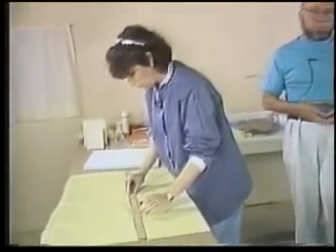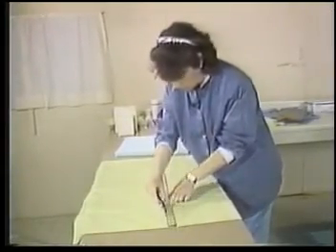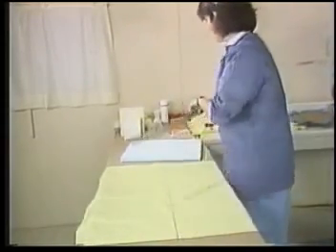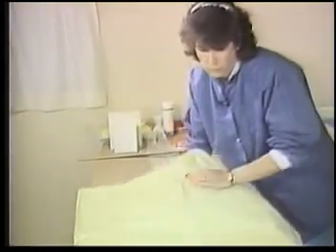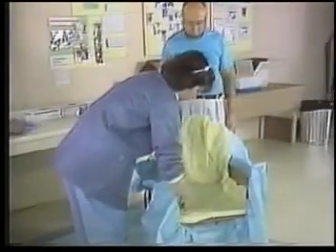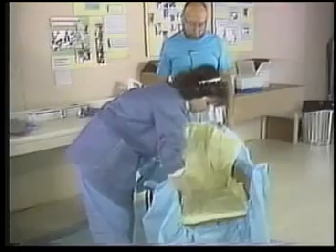Mark the center line from the top to the bottom on the bag using a broad tip marker and a straight edge. This center line will be used later to position the bag in the chair. Place the SunMate base cushion inside the bag. This cushion will become an integral part of the molded seat. The thickness of the base cushion should be determined by the therapist. Place the bag containing the base cushion into the chair and eliminate any wrinkles or restrictions.